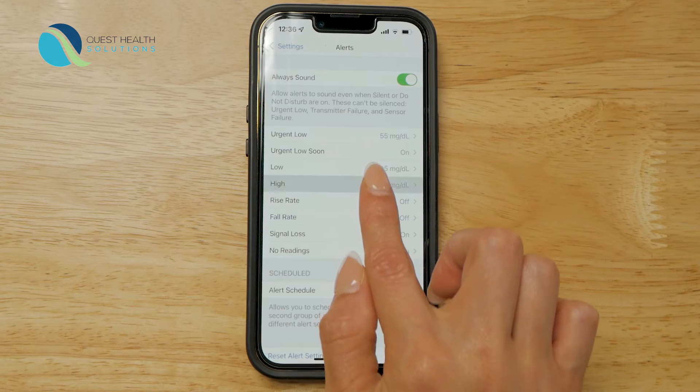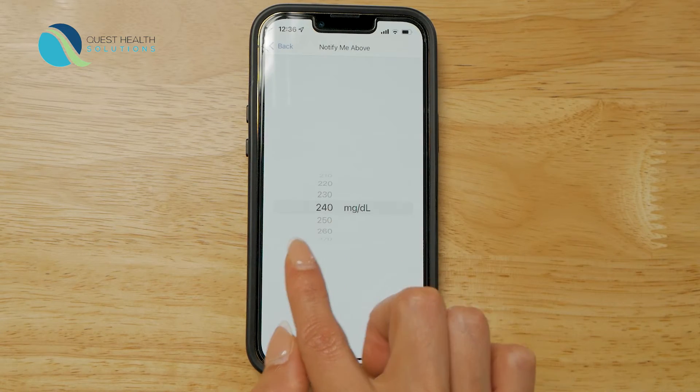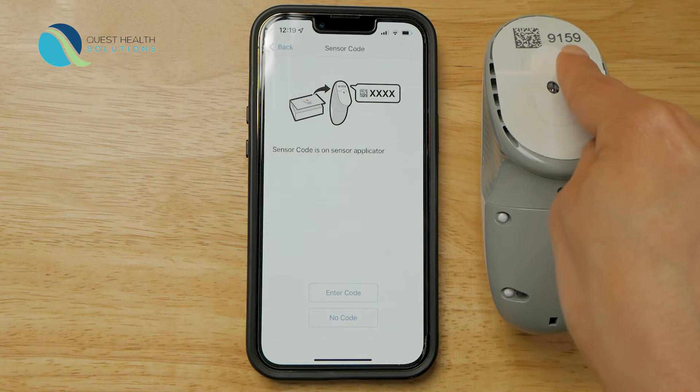Now set your high alert. You should work with your healthcare professional to determine which low and high alerts will be best for you. Next, you need to enter a sensor code.